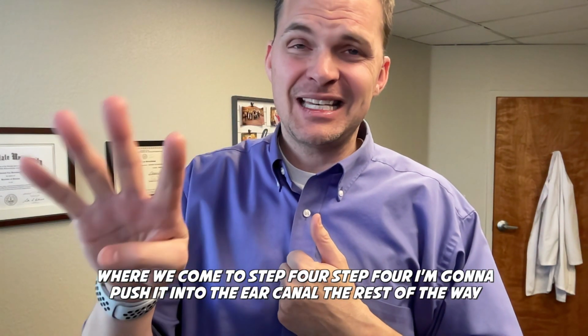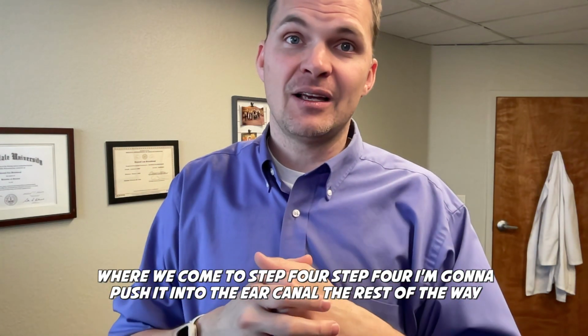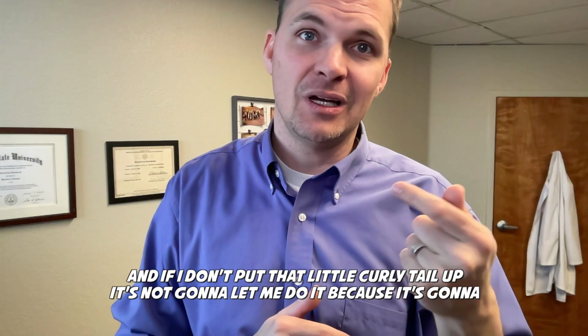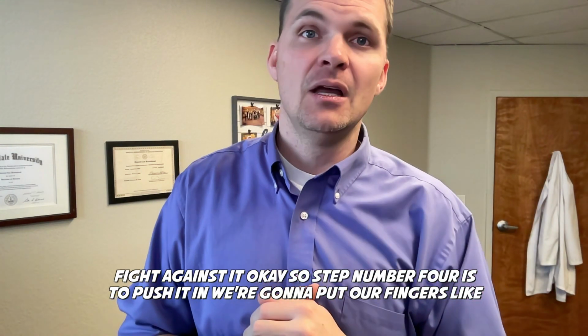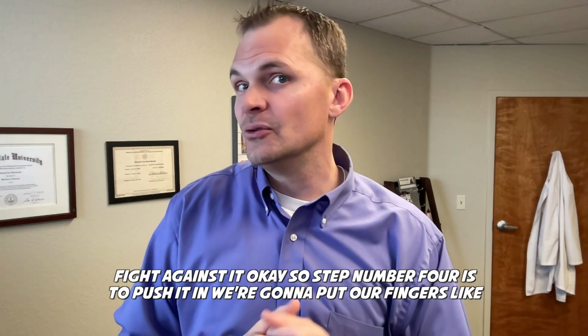And that's where we come to step four. Step four, I'm going to push it into the ear canal the rest of the way. And if I don't put that little curly tail up, it's not going to let me do it because it's going to fight against it. Okay? So step number four is to push it in.